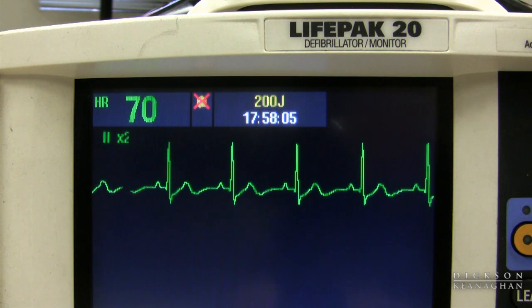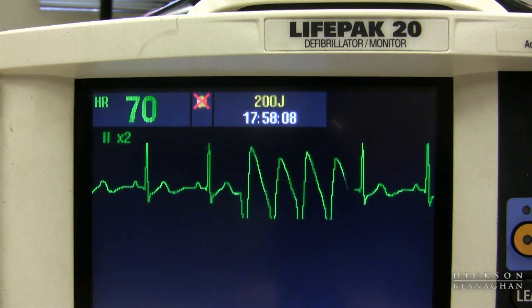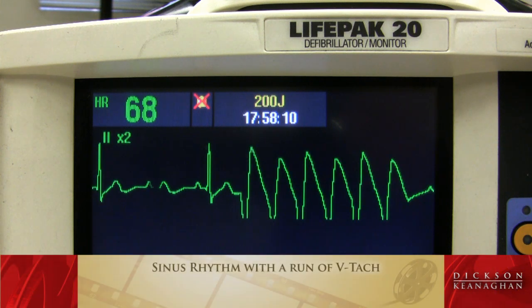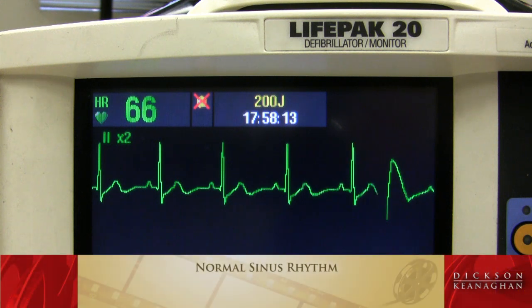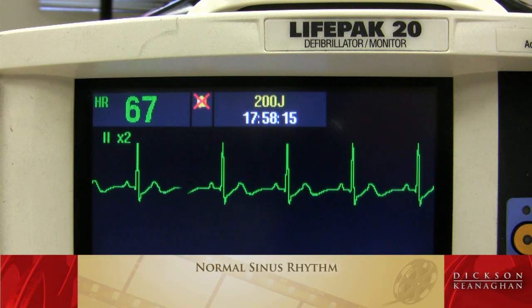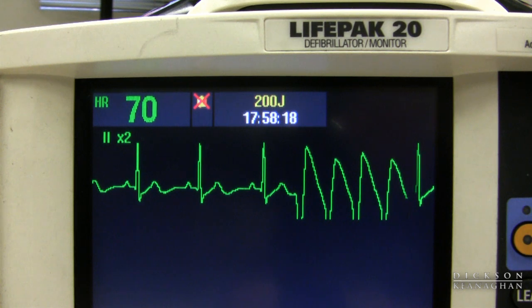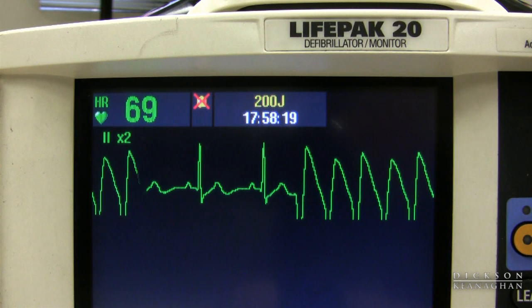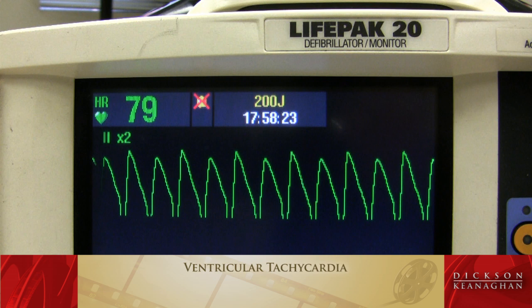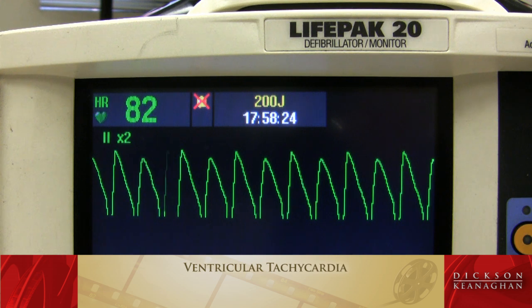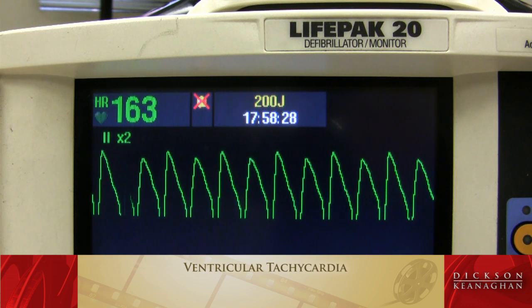Here is sinus rhythm with a run of VTAC, but the patient goes back to a normal sinus rhythm. Here the patient is converting to a ventricular tachycardia. I'm going to check a pulse. If there is a pulse, I'm going to use medications and synchronized cardioversion.